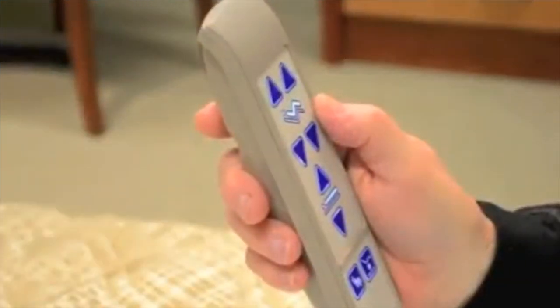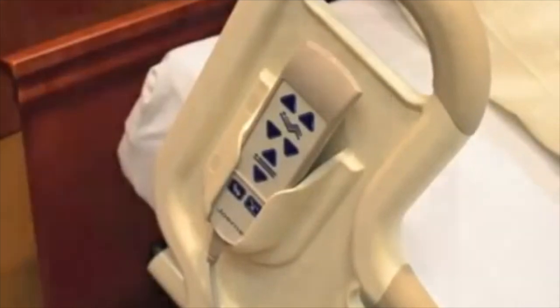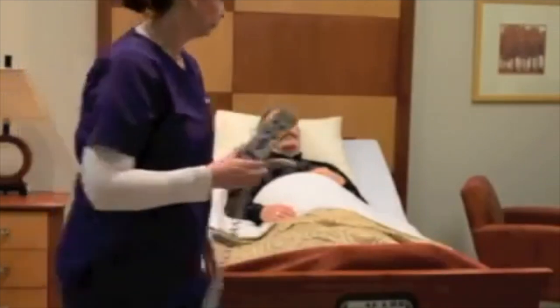The hand pendant can be attached on either the right or left side of the bed, depending on whether the resident uses their right or left hand. To do this, raise the bed to its highest height of 30 inches. Then unscrew the cap and pull out on the cord. Simply take the hand pendant to the side of the bed that works best for the resident and reattach the cord by placing it in the socket and screwing the cap back in place.